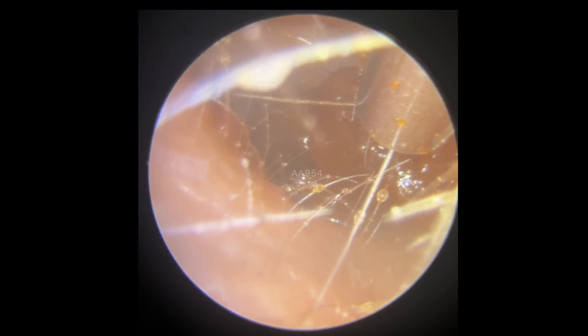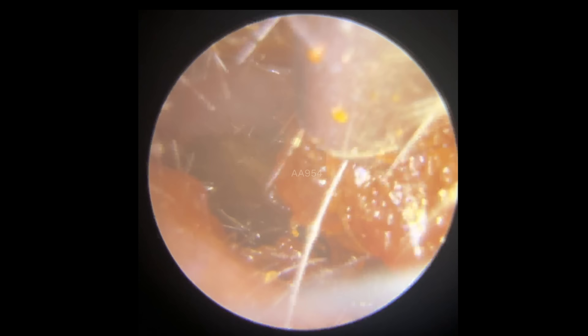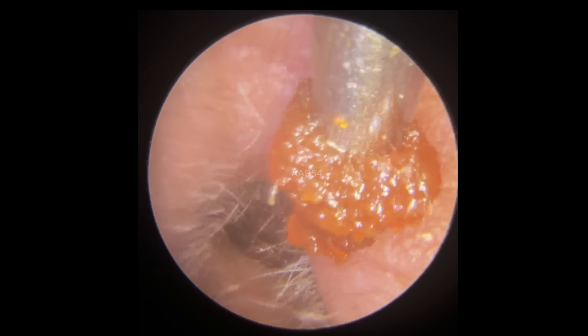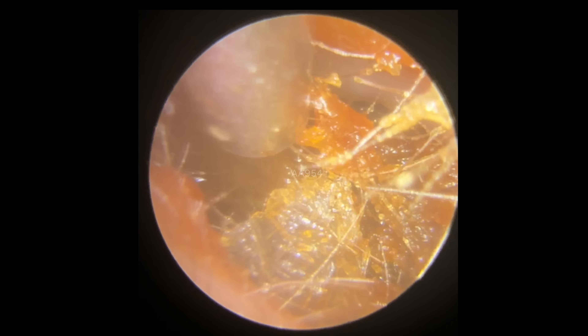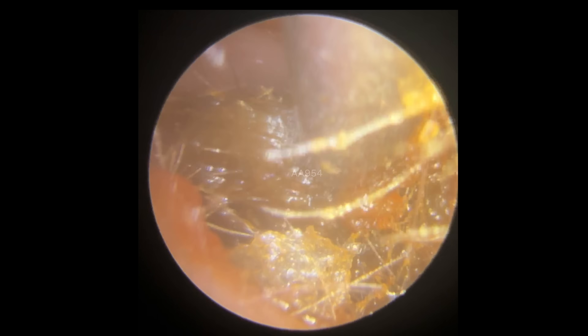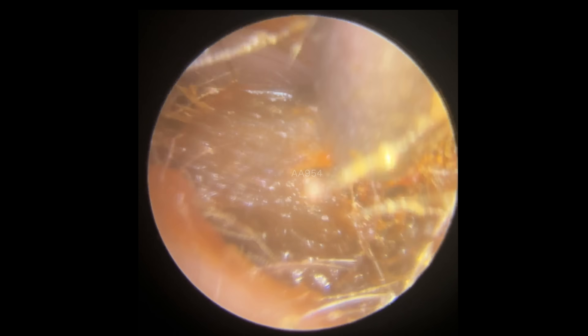We can see a very similar issue on this other side as well. So we're just going to give this a little bit of a lift, try and get this beginning section of the plug. We have a lovely case of surfer's ear — and it is quite an extreme case. For the second patient, it's actually Taylor's patient — he's in our Cardiff branch today so he can't voice over his bit, so I'm voicing over for him as well. Make sure you stay tuned for that one, and also the ruler shot. We're just drawing this plug down towards the entrance of the canal.